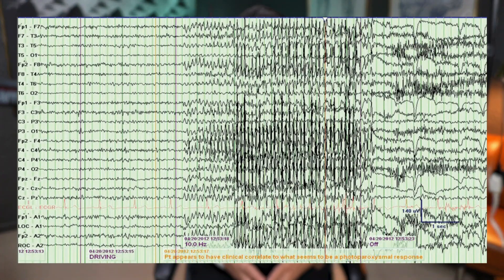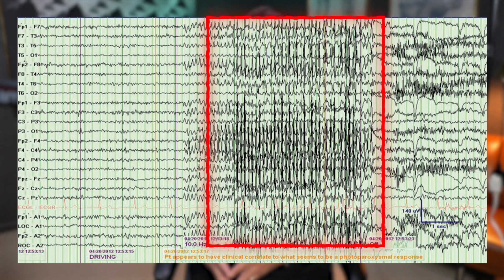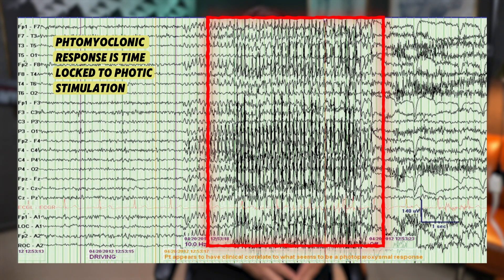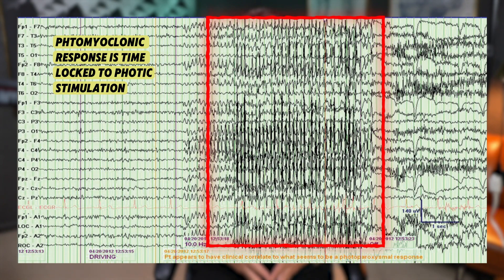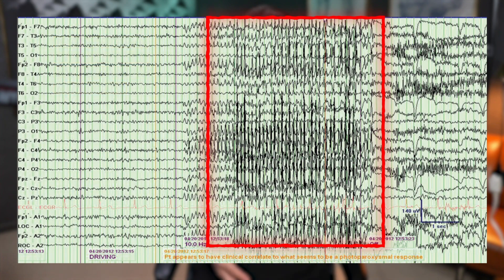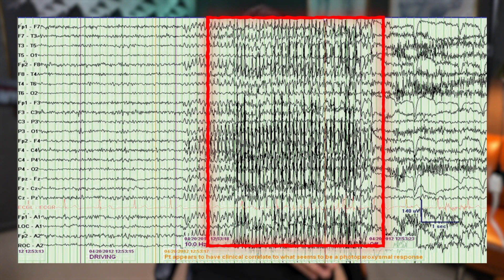The key characteristic of the photomyoclonic response is that it is time-locked to the photic stimulation. This means that the contractions of the frontalis muscles begin and end in synchrony with the light flashes. However, there's often a brief delay between the light flash and the appearance of these myogenic potentials on the EEG — an important detail to recognize.